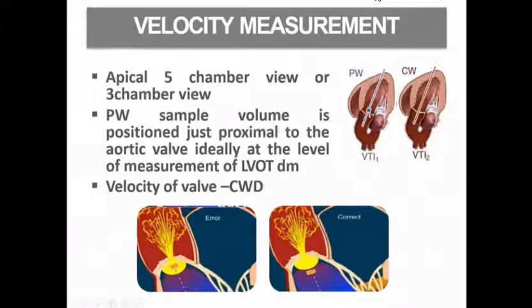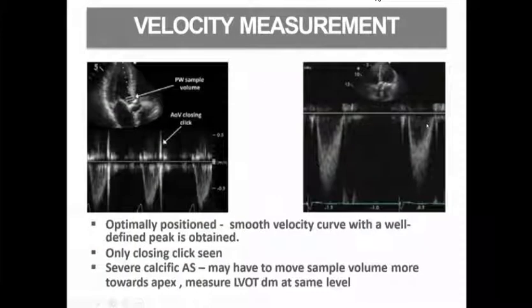So you can see this is the pulse wave; you can keep it just where the valve has been opening. Where you have measured the LVOT, the same position, but LVOT should be measured in the apical five-chamber view. Continuous wave is difficult because, as we know, the pulse wave is the point measurement. So for velocity measurement, you should have done the sampling like we have discussed earlier.